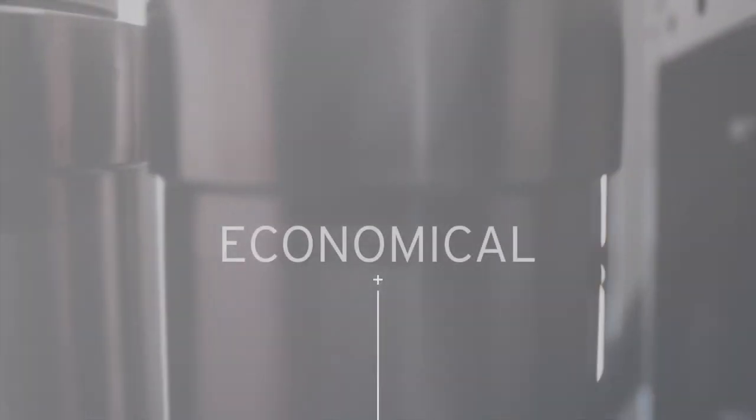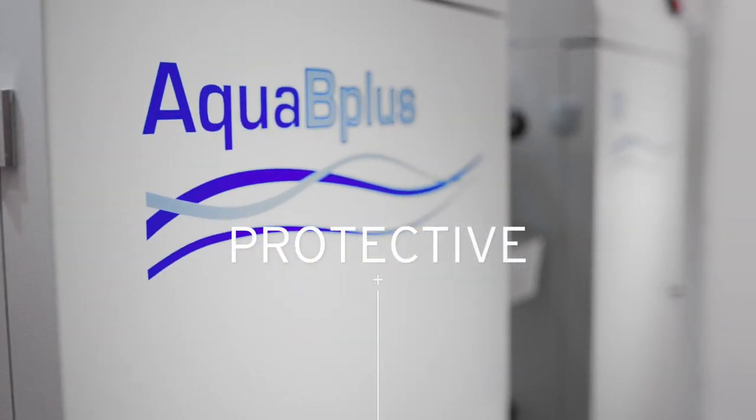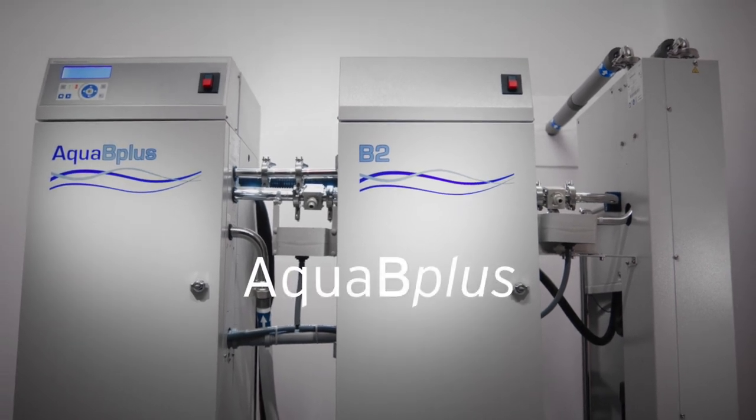Aqua B Plus — an essential part of the dialysis system for the people who matter most: your patients. The Aqua B Plus, the next generation in dialysis water treatment.